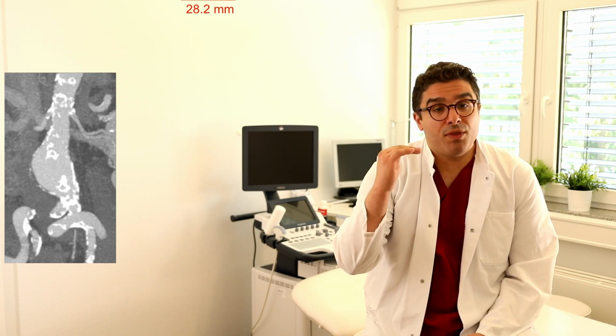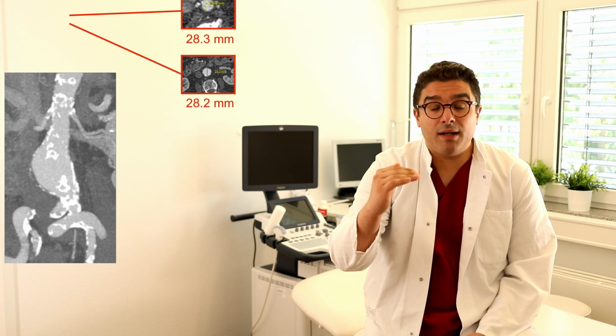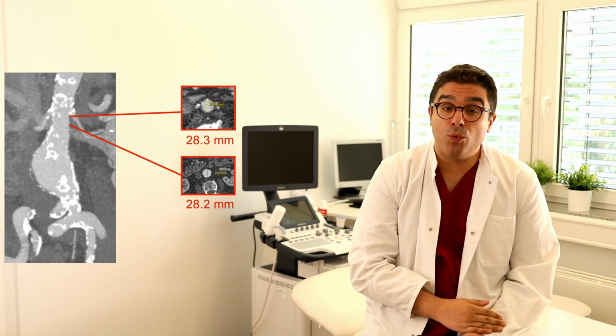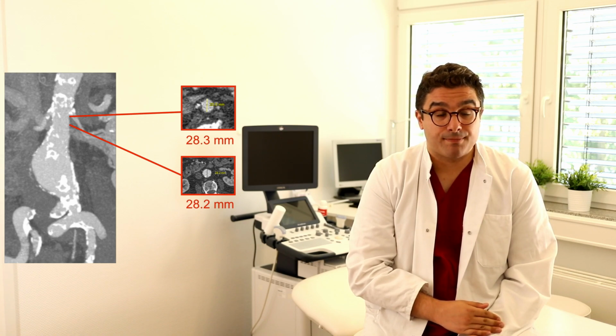Let's start with a simple case of a straight proximal neck. In this case, you have to measure the diameter of the aorta below the lowest renal artery and then the diameter of the aorta up to 1 centimeter below your first measurement.